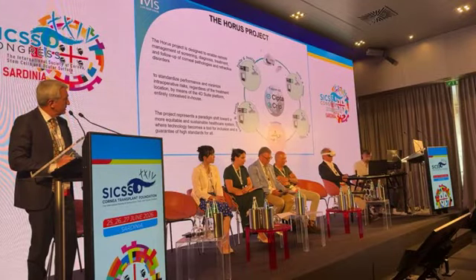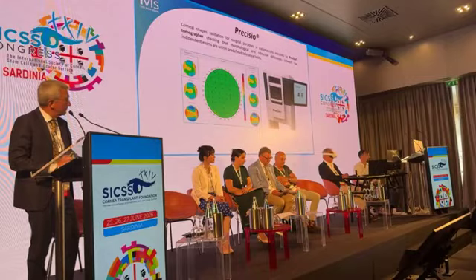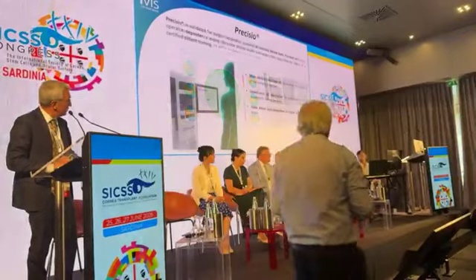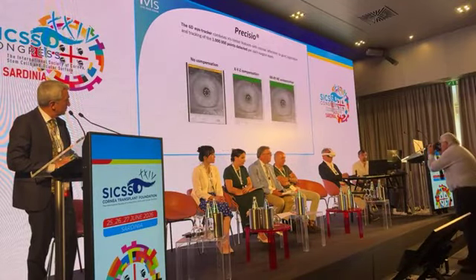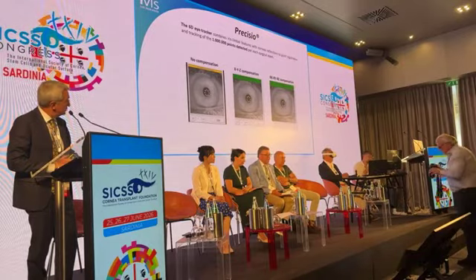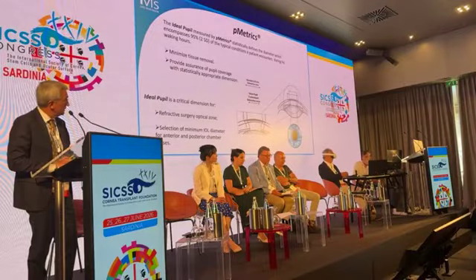For the remote surgery, we are defining the standards for remote controlled surgery. This is the tomographer, which gets repeatability below 3 micron, to be sure that the data are fully in compliance with accuracy below 3 micron, through a dedicated eye tracker. This pupillometer is needed because in this kind of surgery we need to balance the refractive zone to the effective needs of the patient, so never 6 millimeter.